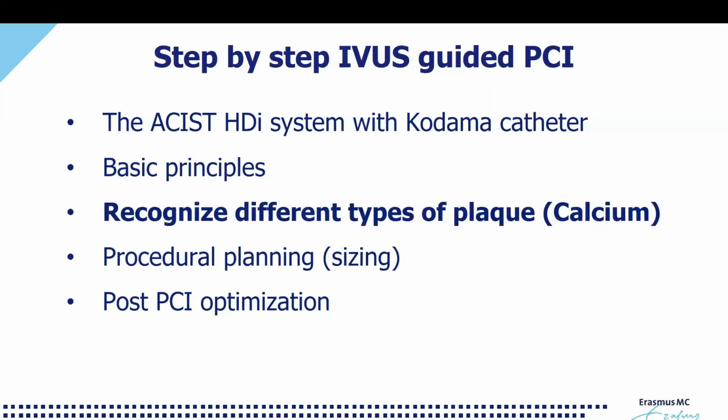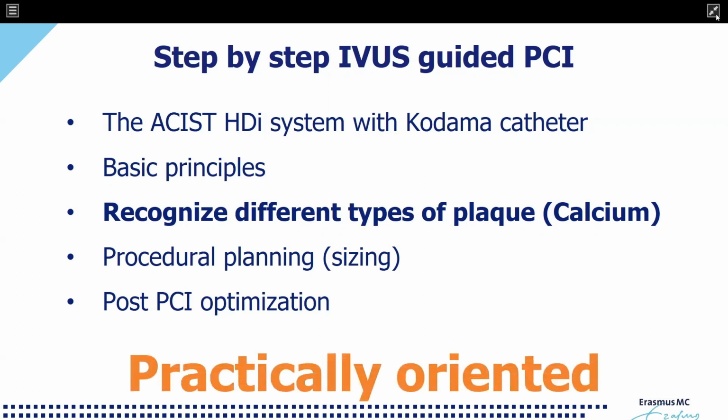And a specific focus for today will be on recognizing different types of calcium and helping you to guide dedicated plaque modification strategies as may be available within your lab. The idea of this course is that it's really practically oriented, so you will see cases which are sometimes really good, sometimes also perhaps not so nice, but at least according to us, yet have educational value.